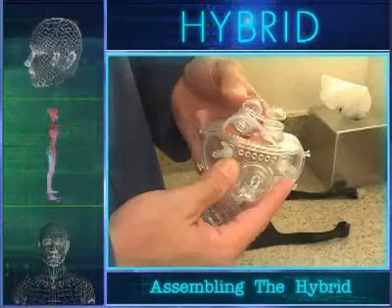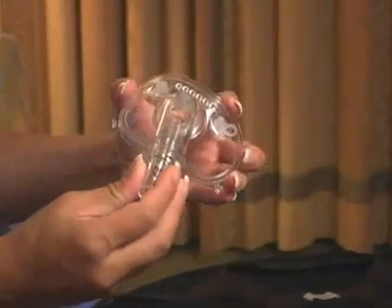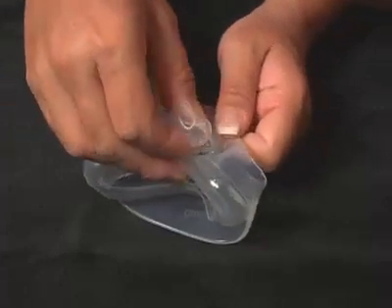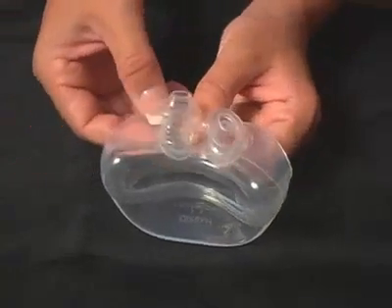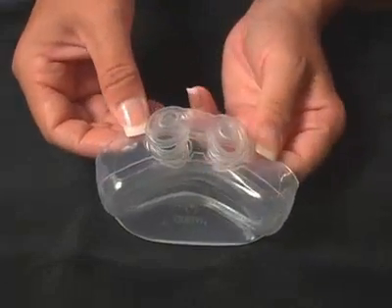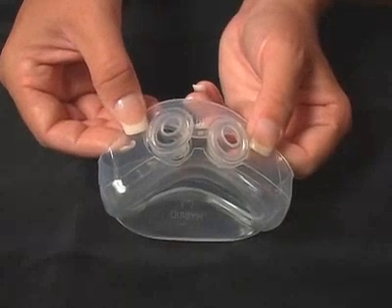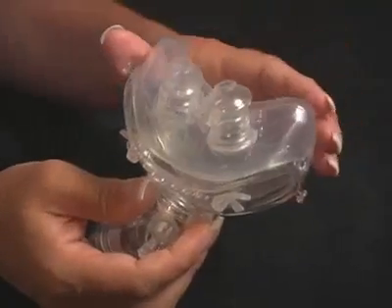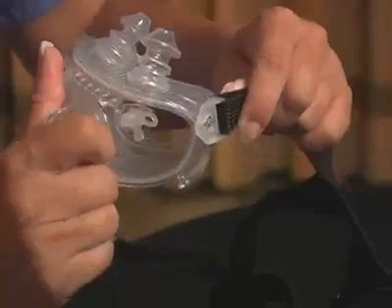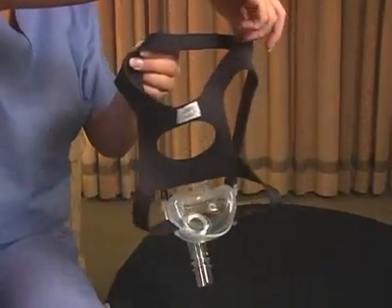Please follow these steps to assemble the hybrid interface. Attach the swivel coupling to the shell elbow. Insert the nasal pillows into the oral cushion and adjust the pillow height to the appropriate position. Note that the silicone bar joining the pillows should lie horizontally between the pillow openings in the cushion and away from the patient's face. Attach the cushion to the shell by inserting it into the groove of the shell. Attach the headgear by snapping the quick-release buckles of the headgear onto the posts of the mask shell. Note that the label on the headgear should face outward and up.